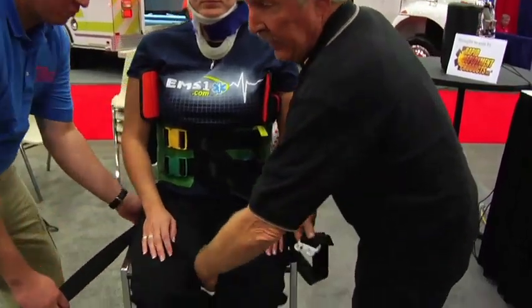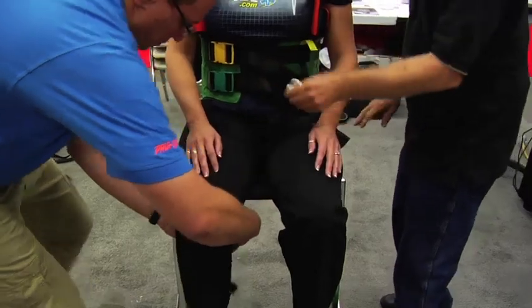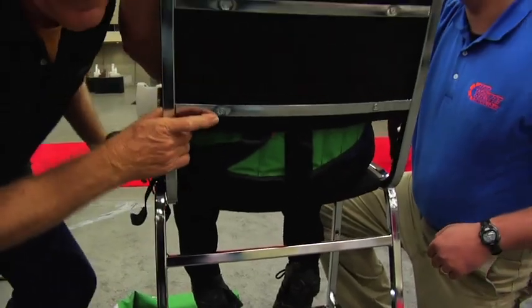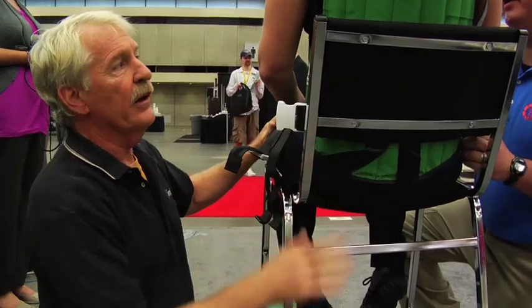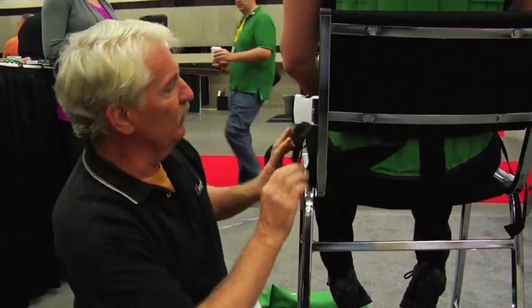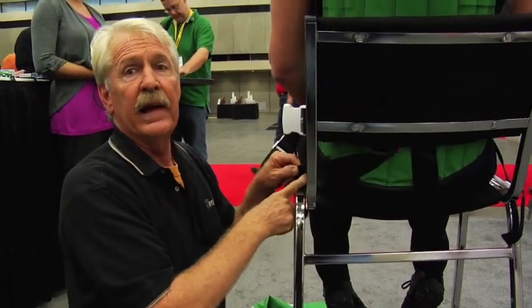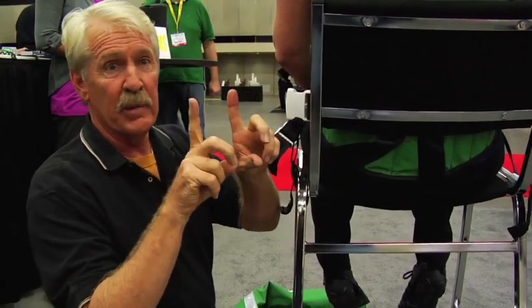Now we're going to place the leg straps. There's another critical area that most people miss. You put it under the leg and you see-saw it back and forth. Here's what gets lost when you're doing it in training — in a classroom there are certain portions, particularly on a female, that are no-go zones. You don't want to touch their derriere, you don't want to touch their breasts. So quite often, because you're afraid to touch it, you leave the strap way outside the thigh. This is what happens when you lay the patient down — they stay in a dying cockroach position with their legs up in the air.